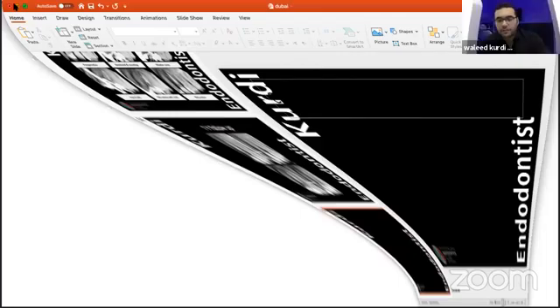Dr. Shahram Azimi asks: 90 degrees clockwise, 30 degrees counterclockwise, does it come from your trial and error experience? Oh, no, only experience. All right. The second question: if I break a file at the apical part of the canal, it will be closed, normal canal path, otherwise if bypassed, it will change the pathway and lead to a ledge.